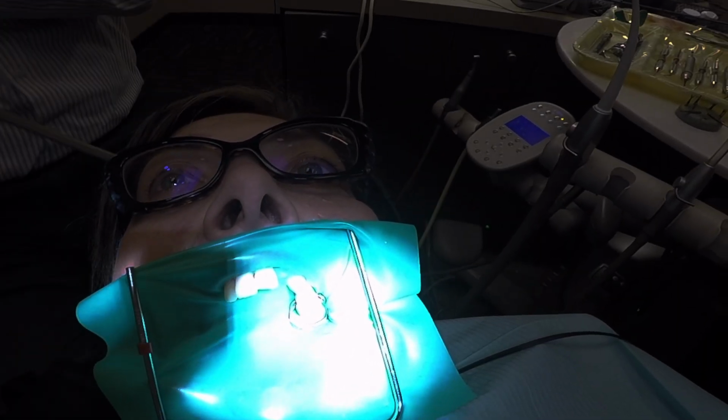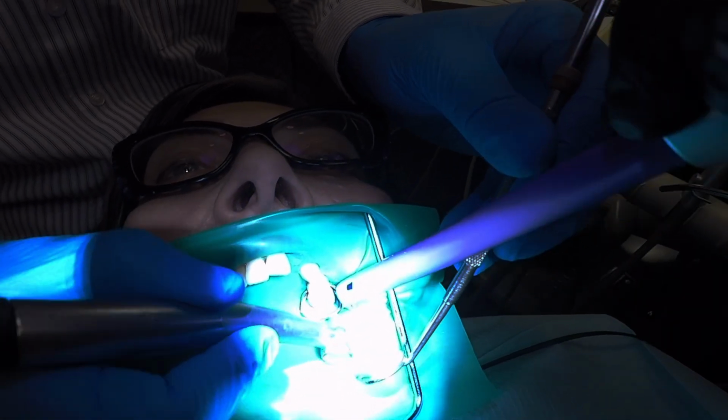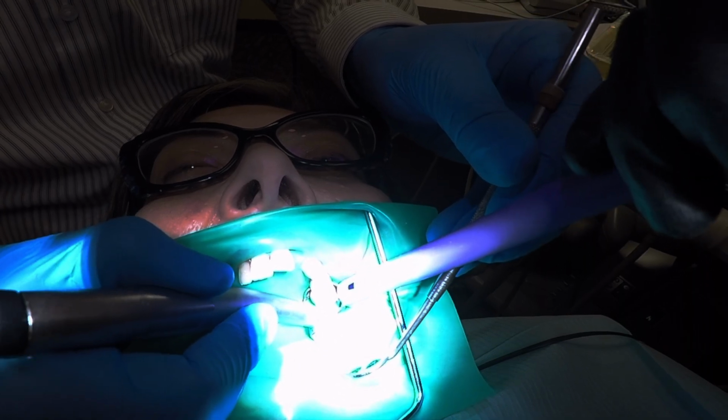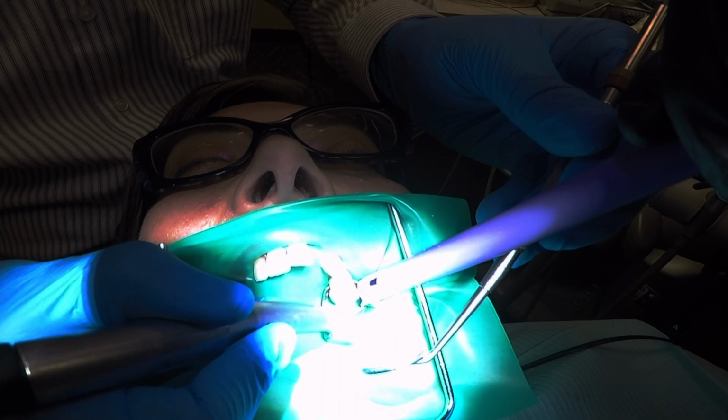So the root canal part of it is done. So now I'm just taking out the rest of the temporary. I had left some just so that we could wall everything off. And then we'll just put the filling in there.